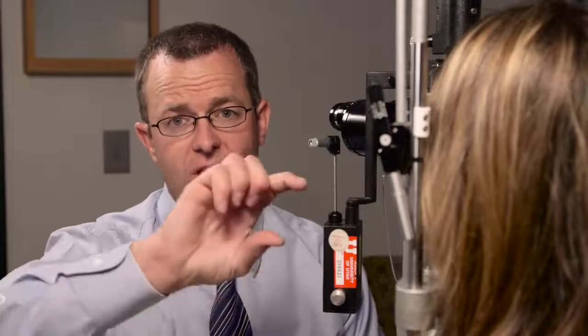After looking at the macula, then generally I will swing and look at the blood vessels. I'll travel along the superior temporal arcade and the inferior temporal arcade and get a good look at the blood vessels. And then I'll look a little bit past that. In general, with the 78 diopter lens and the 90 diopter lens, you can see into the mid-periphery, past the macula a little bit. From there, you're going to take over with your indirect ophthalmic exam. And so those are the basics of the slit lamp exam, looking at the posterior segment of the eye. And now we'll switch over and go to the indirect ophthalmoscopy.